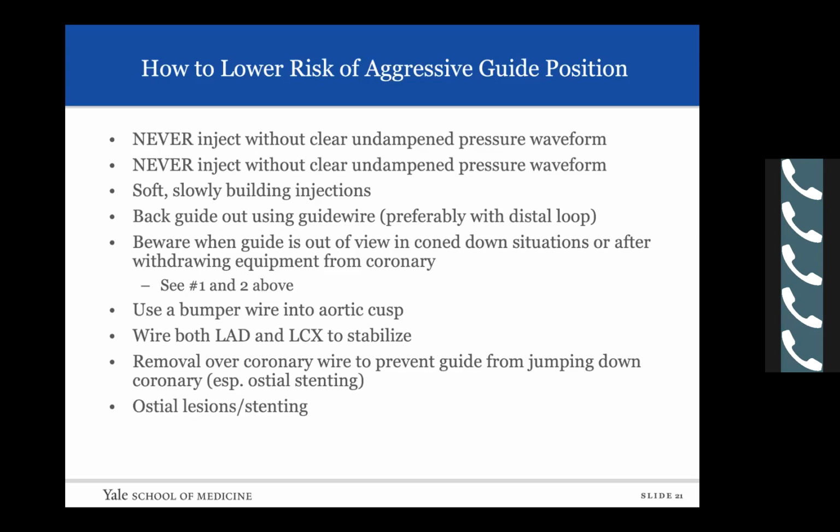And this is especially important if you're positioning a stent, you're coned in, you have an aggressive guide position, the stent's distal, you pull it back, and the guide comes in as you're pulling the stent back, and you end up with a guide dissection in the ostial vessel.